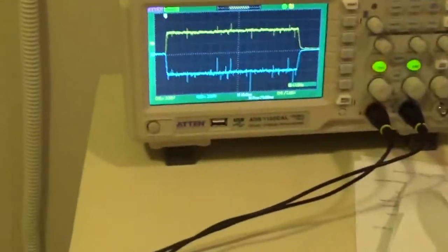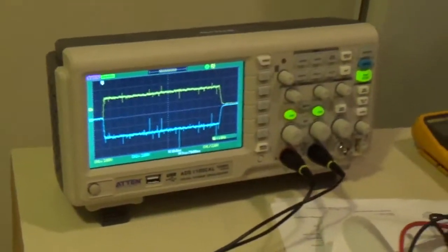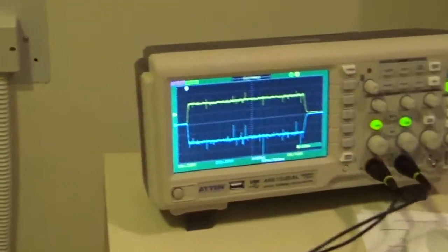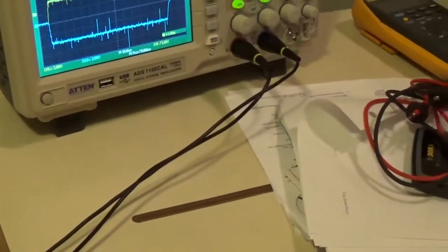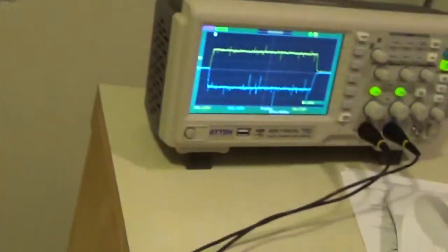So you're spot on. And you'll find out that that's a function of the inverter circuit in here. So usually you set that and forget that. It'll never change. The only time you can get into trouble with that is if you change the X-ray tube type. If you put a different model of X-ray tube that has a different anode cathode spacing and all that, then that would change a little bit. You may have to adjust your inverters.